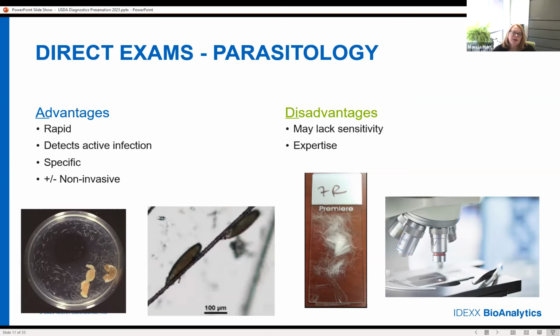Disadvantages of parasitology is that it can lack sensitivity. Again, thinking through the whole process, did you collect the appropriate sample type? Was staff appropriately trained? Were they able to identify the eggs or the actual agent itself? And then, as I said, there's lots of expertise and training that goes along with parasitology.